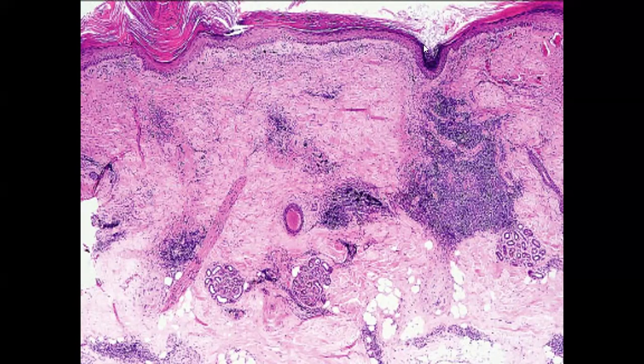In addition, the intervening epidermis will be thinned out and will show basal cell degeneration with pigmentary incontinence, and there will be a dense perivascular and periadnexal lymphohistiocytic infiltrate. So the infiltrate will be surrounding the vessels, the sweat coils, and the hair follicles. But the basal cell degeneration is seen throughout the epidermis, and the follicles only show hyperkeratosis.